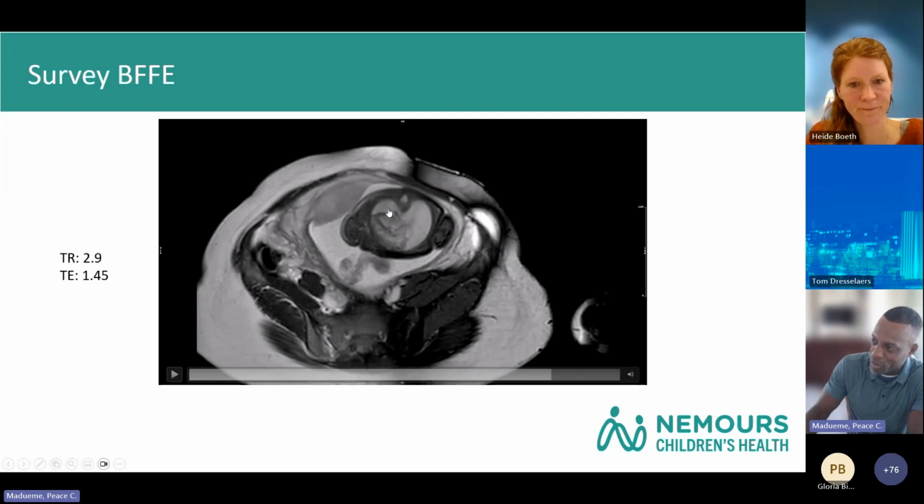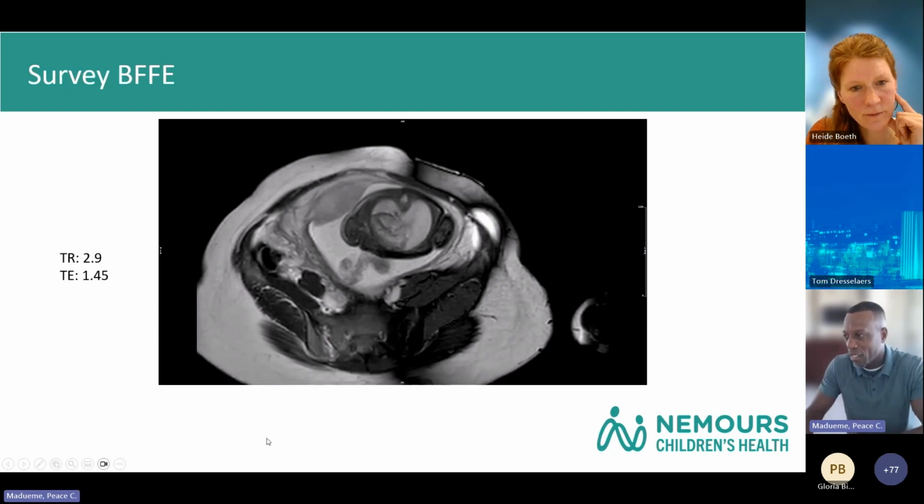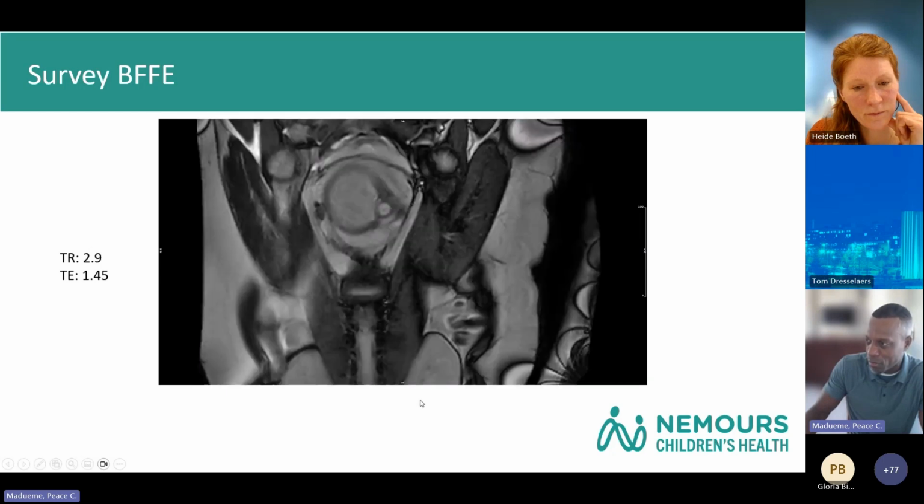But if you will notice, this is the spine here, and already the heart position is really, really weird. So this is the spine here, this is the left ventricle, this is the right ventricle. And so the orientation of the heart is very unusual. But this is mainly just to show that the transducer was here, and we got, for the most part, a very reliable signal for about 30 minutes of this scan before it started becoming unreliable. But then we were a little bit too far into the scan, and we didn't want to push our luck with repositioning it.